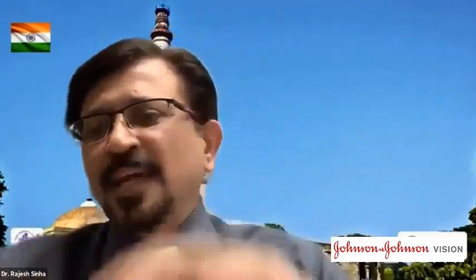I think, Rajesh, you also have experience of doing it in children. Would you enumerate? Yeah, I've done it quite a lot in children. I've combined it with the endothelial keratoplasties, wherein I have single chambers when I do these blue dye techniques and then combine these pupilloplasties. So it works very well, and it is really very useful to have a good tamponade with a nice pupilloplasty. So the air tamponade is very good and the results are quite good.